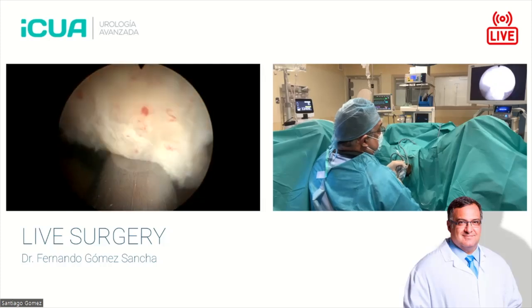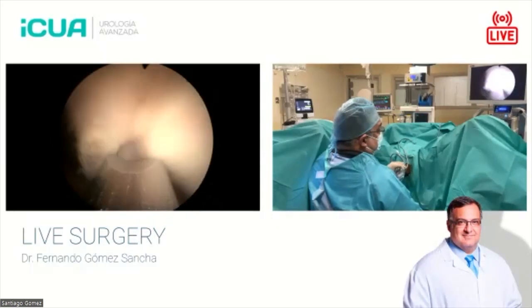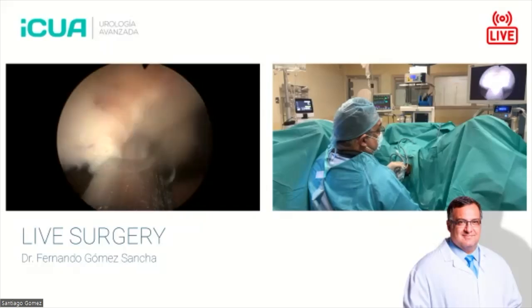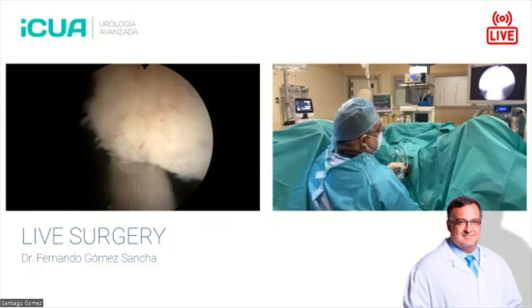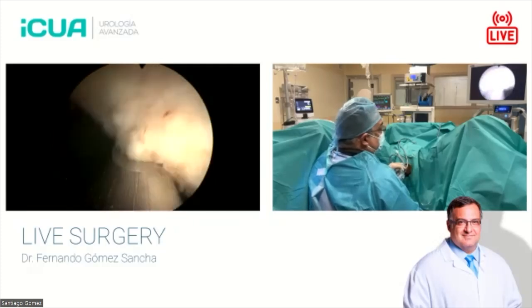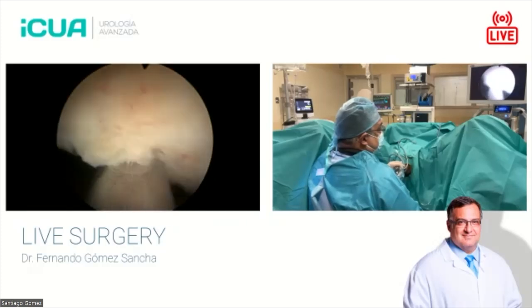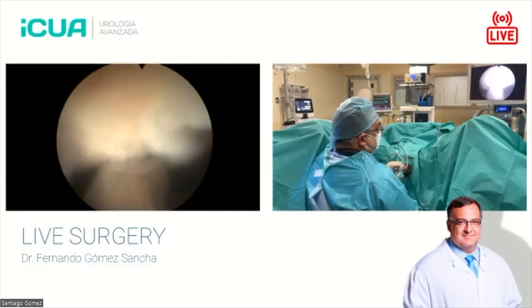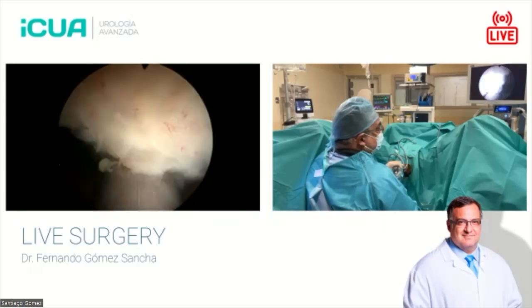We should make a study together in the center and find the factors which can influence this. Yes, but the variability of what we do is so much. For some guys, HoLEP is a 3-hour operation. They do 3-lobe. They go with a resectoscope and they coagulate a lot at the end. So if you want to come to a conclusion on such a question, it's very difficult to account for all the factors involved. HoLEP, more or less, we have the same concept, but the practical application varies a lot from center to center. And I don't know if we could find an answer easily.